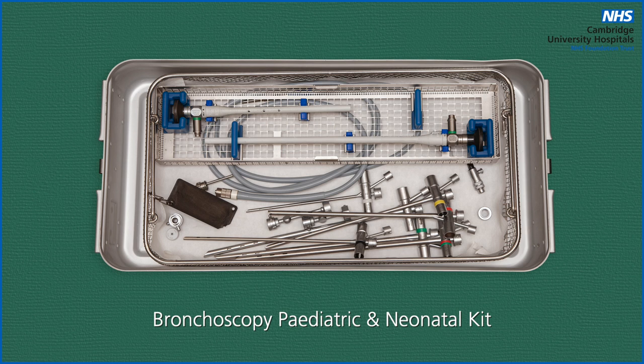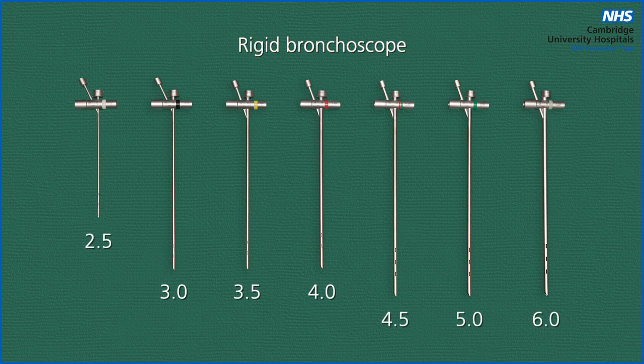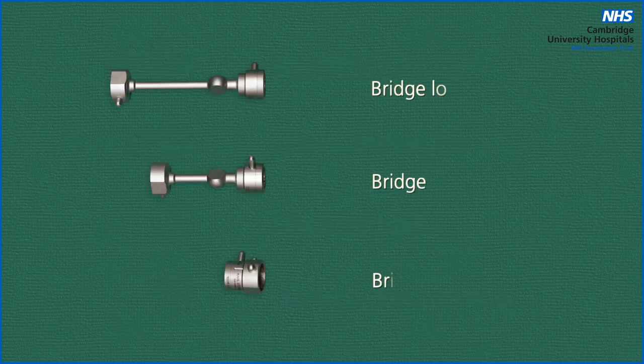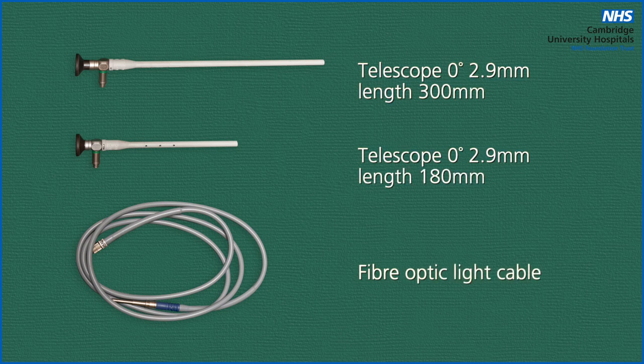This is how the set commonly arrives from the sterile service decontamination unit. Within the tray you will need to find the range of bronchoscopes from sizes 2.5 to 6, the light carrier prism, the suction catheter guide, glass window bung, and telescope guide with bung. You will also need to find your long, medium, and short bridges, your 2.9 zero degree telescopes, and light cable.